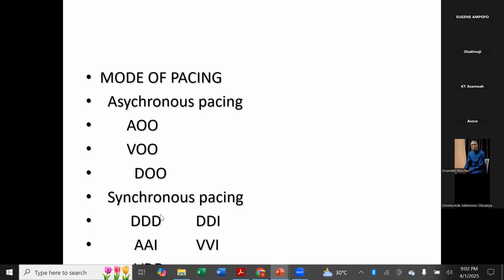Okay. So in that situation, you will do a DDI. So what does a DDI do for you? With a DDI, the I component helps you inhibit pacing, especially in the ventricle or in the atrium, when necessary. So let's look at an example now. When you program a DDI, you program an upper rate limit that can be 130 beats per minute for both chambers. So the ventricle has an upper rate limit programmed at 130 or 140 beats per minute. So when the patient goes into a high atrial rate of 250, maybe he has atrial flutter and goes into 250 beats per minute.